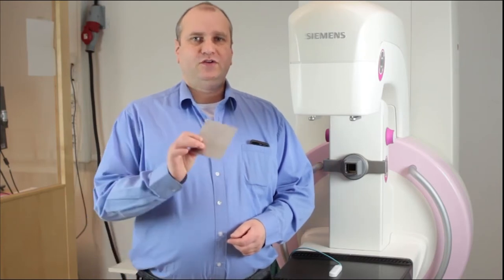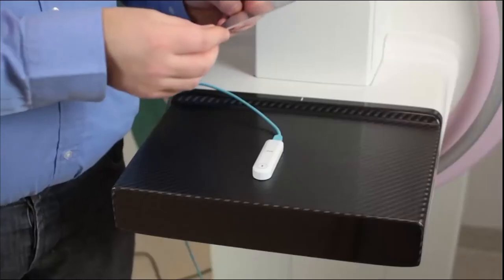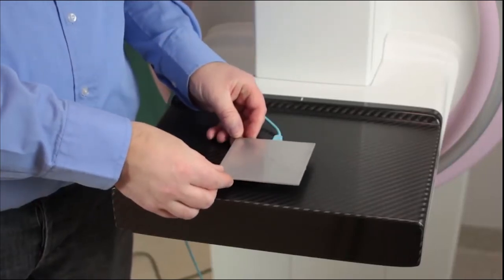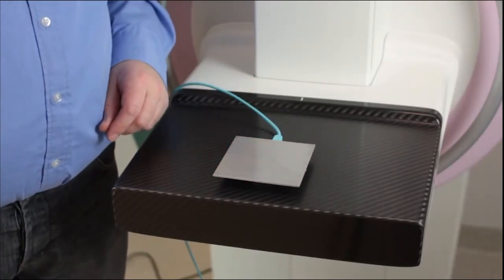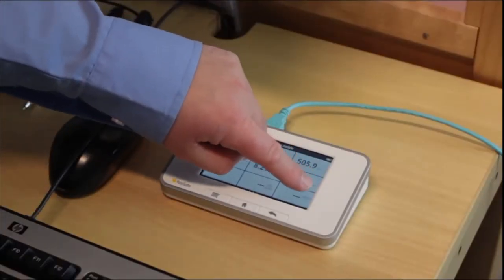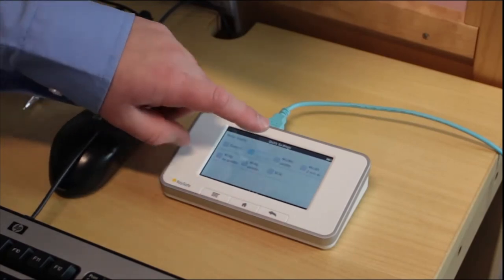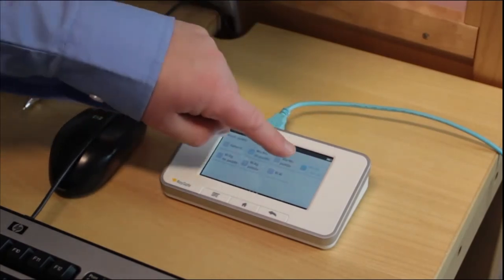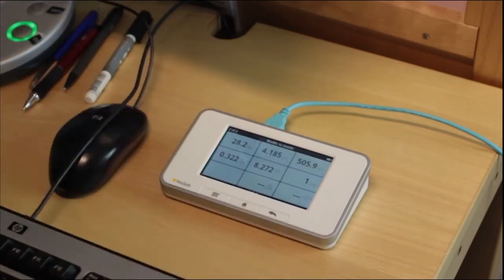For KVP parameter on molybdenum beam quality, you need a 2mm aluminum filter. Place it directly on top of the sensor, and now we do the settings and make the exposure. To be able to get KV for molybdenum, we need to check molybdenum 2mm aluminum and then go back. Make a new exposure, and now we get the KV value also for molybdenum.